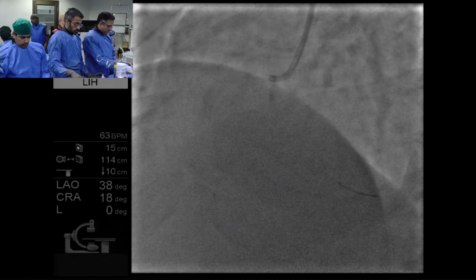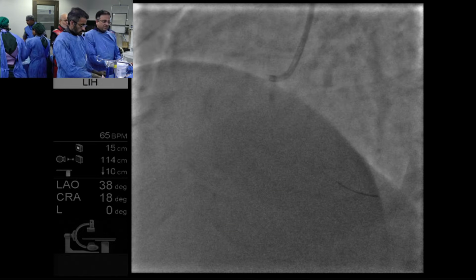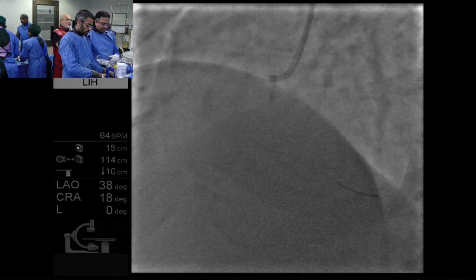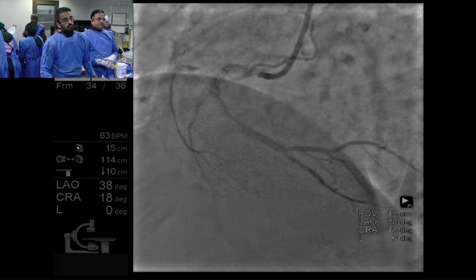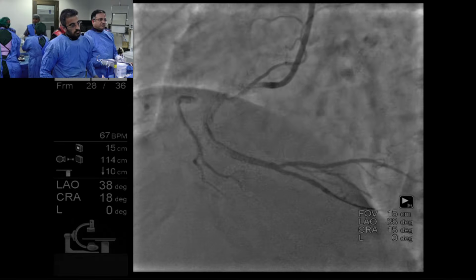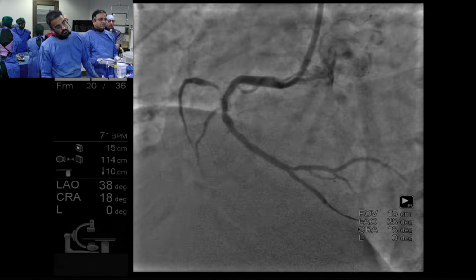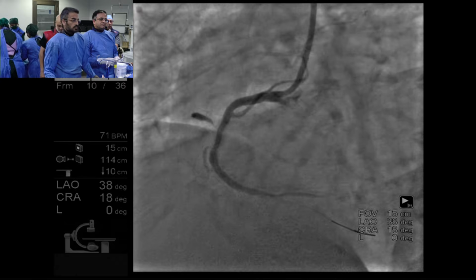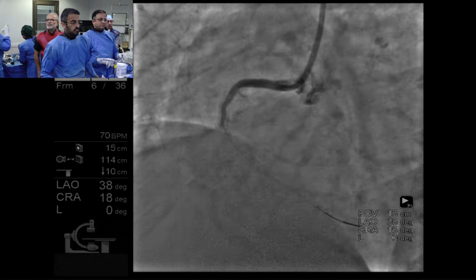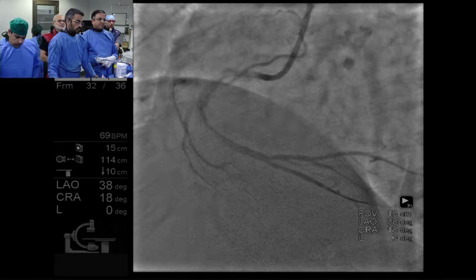I think that it is 3.5, 4 years old. I think it's a lot of neoatherosclerosis, neoatheroma? Chances of the patient having calcium are less. Yeah, I agree with you. I think the stent silhouette itself looks reasonably sized, and it seems like the lumen loss is more inside the stent, and with the age of the stent, that makes you think it's neoatherosclerosis. Yep.